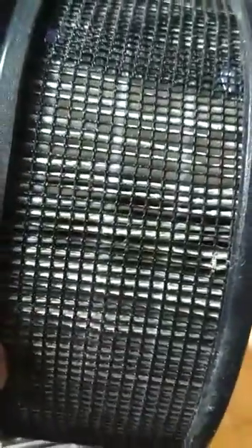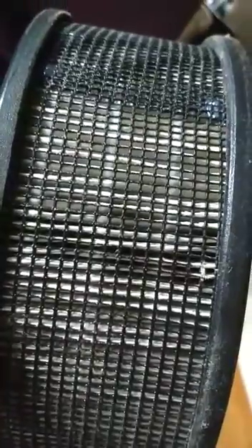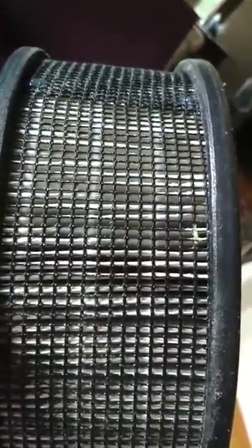That initial pre-filter here, let me remove it. The pre-filter is activated charcoal. Now we'll discuss what the activated charcoal is in a moment. First, let's look at the paper filter. This is the paper filter, and it's very similar to the HEPA filter going into the intake of the compressor. It is by far and away the thing that creates the greatest resistance because it has the smallest holes. The smaller the holes, the more resistance that you have and the more particulates that you capture.